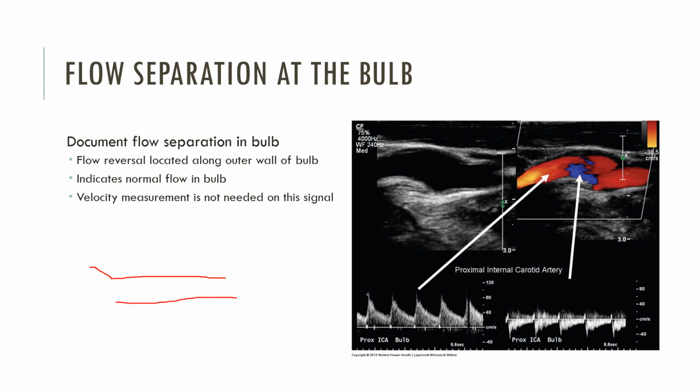Now at the origin of the bulb, we have this vessel coming in, and then we have a dilatation, or the bulb. Because of that, the bulb will then basically turn into the ICA, and then we have our ECA come off there. Because this bulb is a sudden dilatation, we would expect to see some turbulence, just like we would see post-stenosis. So you see the blood flow start to curve around and then get going straight again.